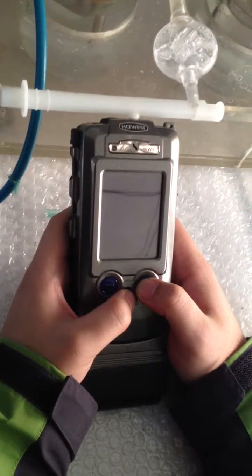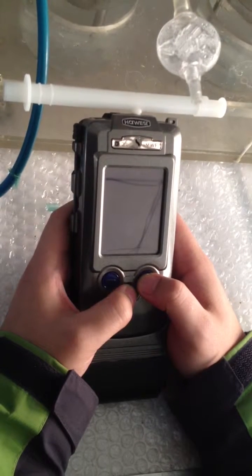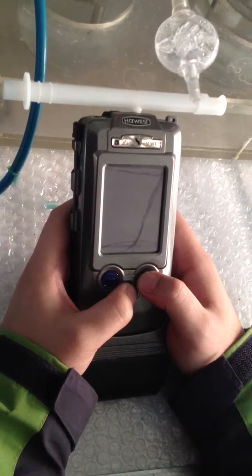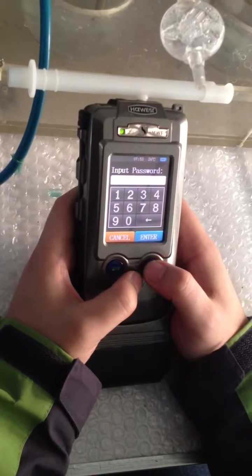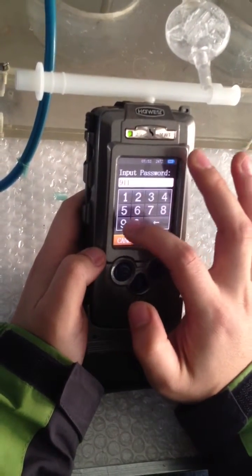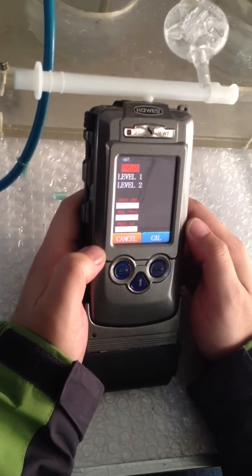I'm going to show you how to calibrate the professional breathalyzer AT8900 under powered condition. Press the middle and red button simultaneously and continuously until you see a password interface, then loosen the hand immediately. The password is 911911. Press Enter and you will see the calibration display.